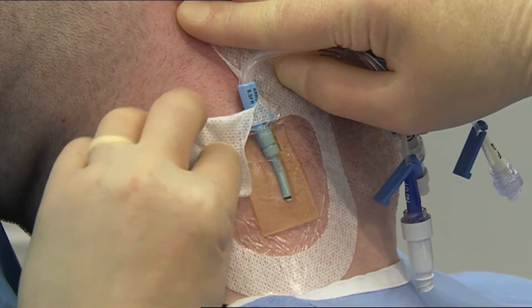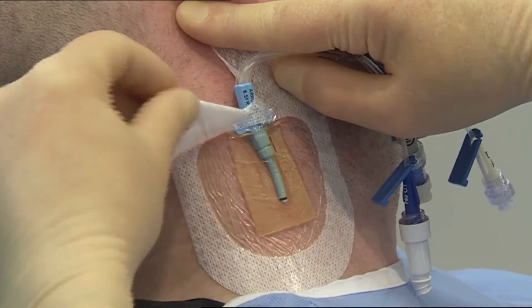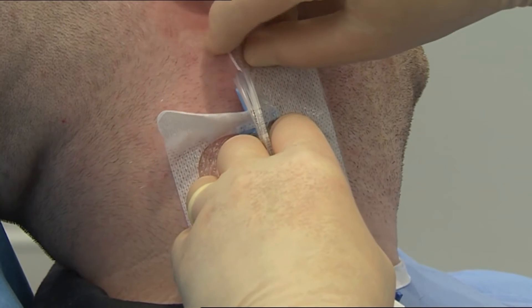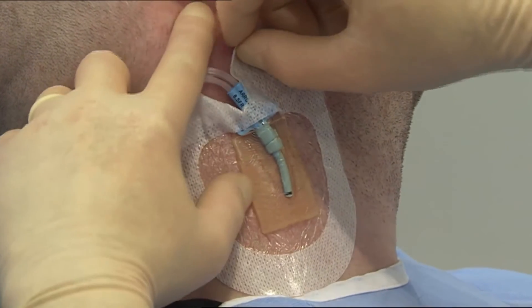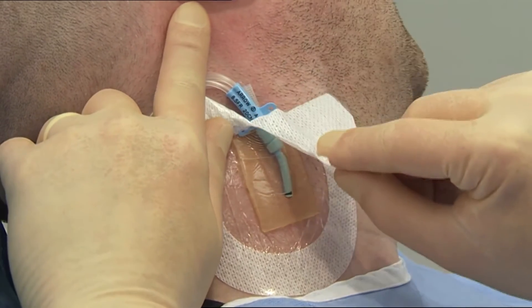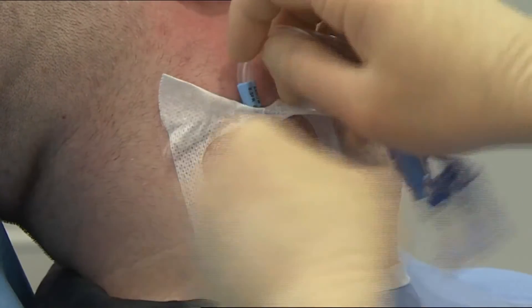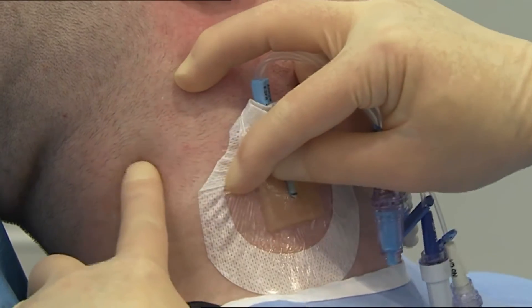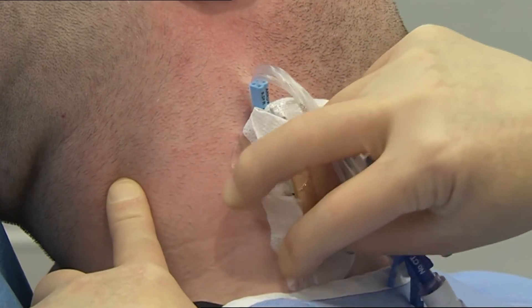Separate the soft cloth section from underneath the lumen and slowly peel the dressing from the skin towards the insertion site using a low and slow technique. You may find it useful to fold the soft cloth in on itself. Keep removal low and slow. Do not pull the dressing straight up from the skin as this can cause potential skin trauma.